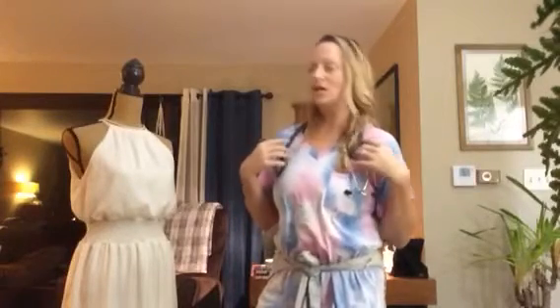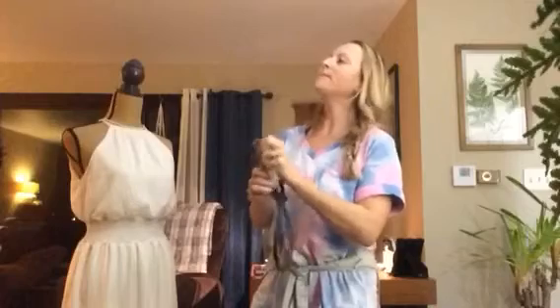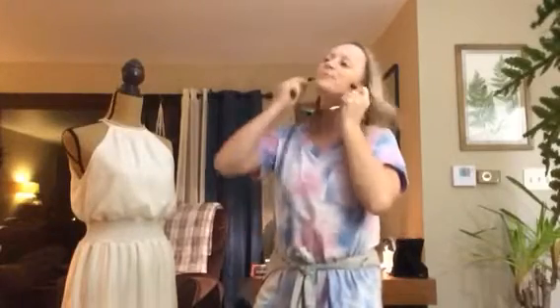So in auscultation, I would instruct the patient, inhale through your nose, exhale through your mouth. So let's go ahead and auscultate. And I'll be listening. There are normal and abnormal sounds, which I'll go through in a minute.